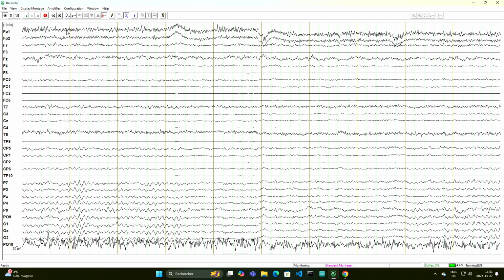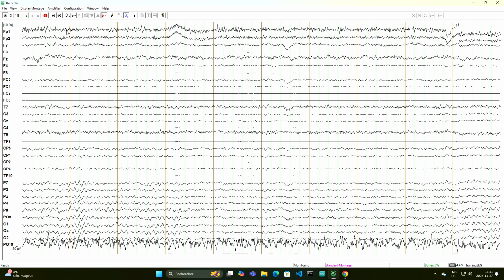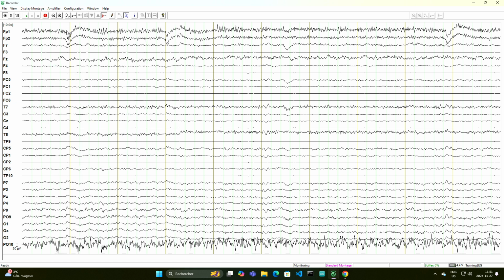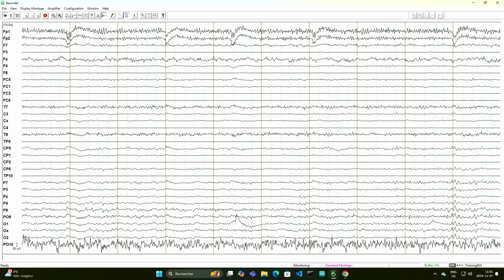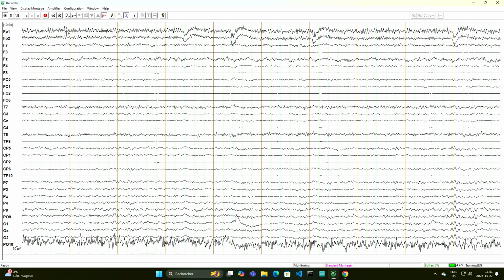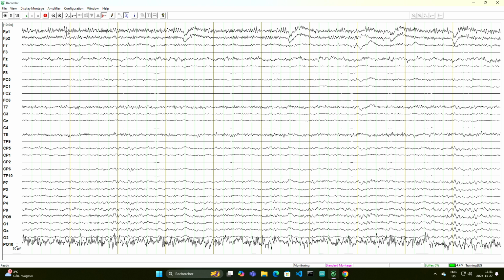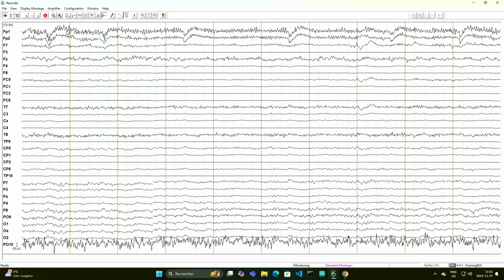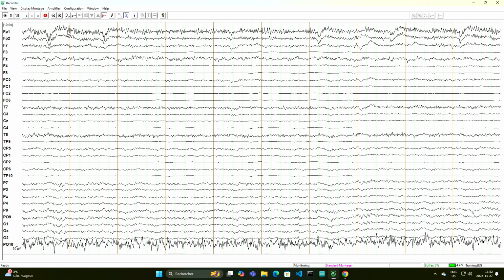One more time, please close your eyes. And open your eyes. And when she opens her eyes, you can see that the amplitude again drops back down. Once more, it is particularly noticeable in P7 through the occipital electrodes. This matches with classic literature on the observation of the origins of alpha signal, which are typically seen in posterior and occipital electrode sites. Thank you very much, Anne.